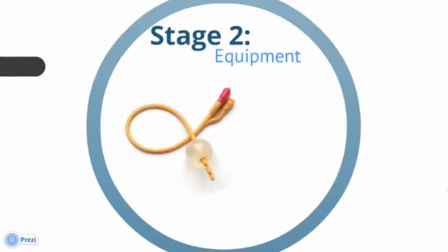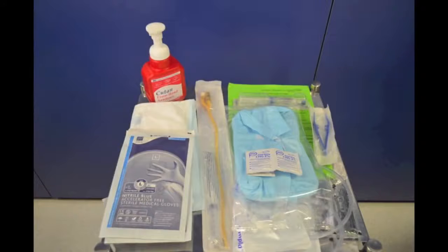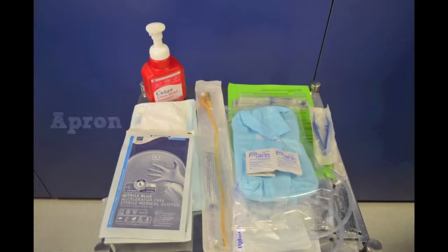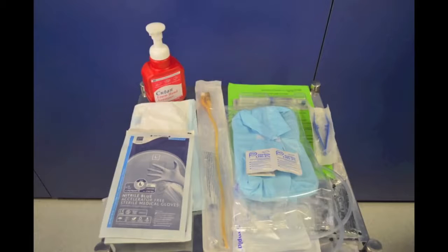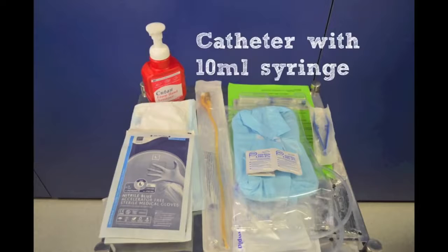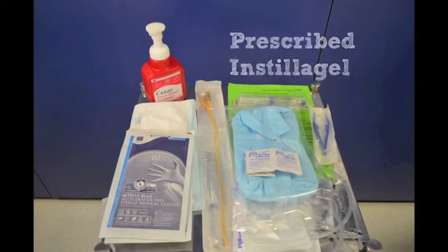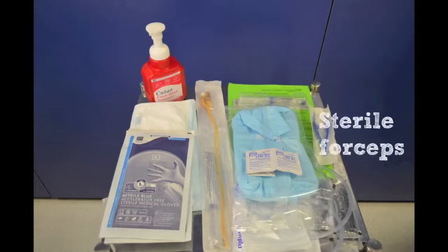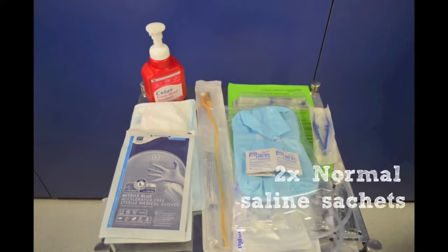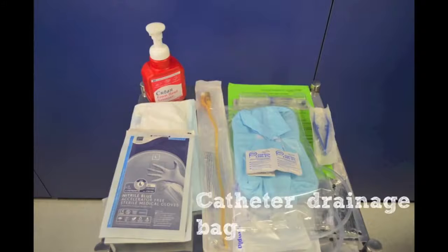Stage 2 requires you to gather the equipment for this procedure. The following items are needed: a clean trolley, hand sanitizer gel, an inco pad to protect the patient environment, an apron, two pairs of sterile gloves, an appropriate size catheter which includes a sterile 10 millilitre syringe for inflating the catheter balloon post insertion, a catheter care pathway form with green sticker for medical notes, prescribed Instilagel, a pair of sterile forceps, a catheter pack, two sachets of normal saline for cleaning, two chlorhexidine wipes to clean the saline sachets, and a catheter drainage bag.